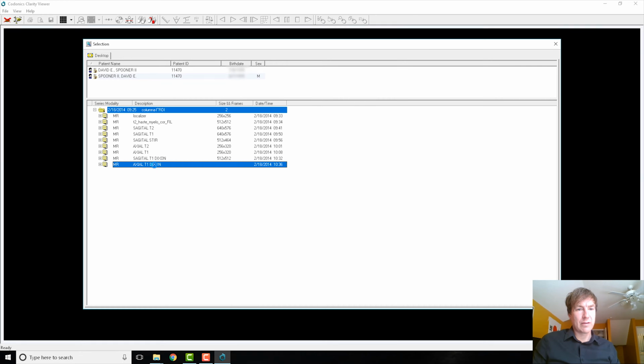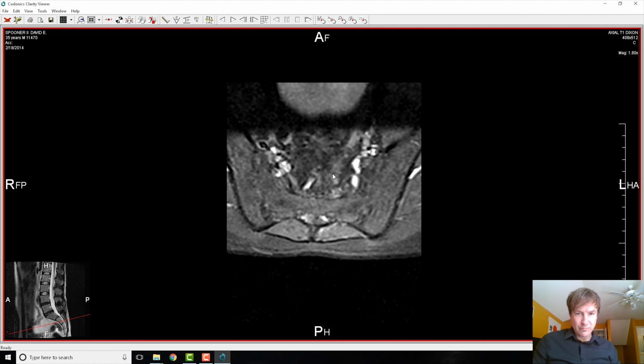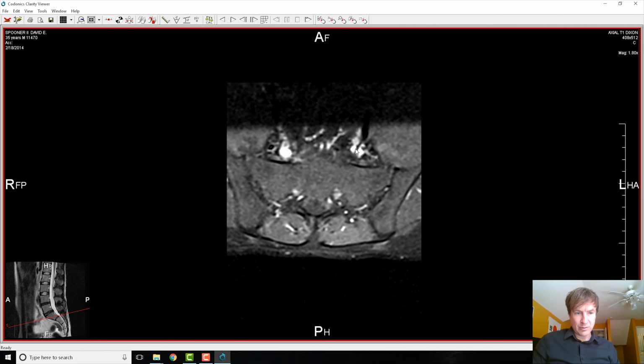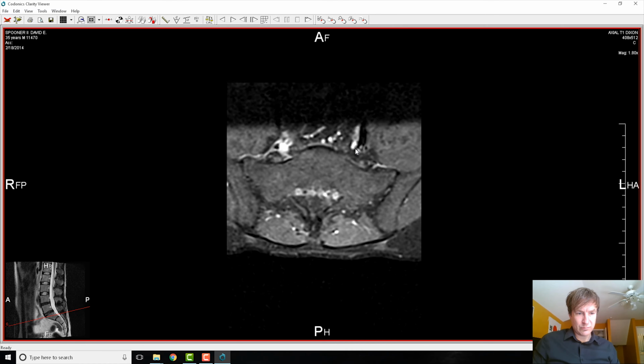I feel like it's important to show you all of the MRIs and just comment a brief history of what's going on, so that it's all in one video and on record, and you can see exactly how things have progressed over the last 10 years. So here we go again.